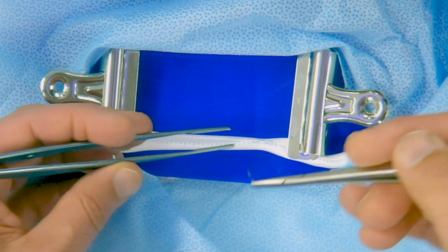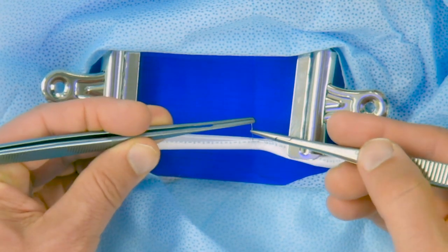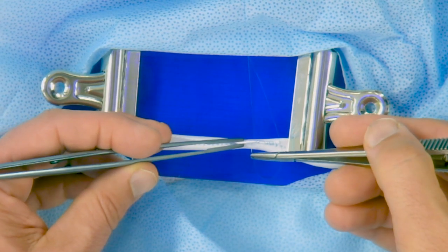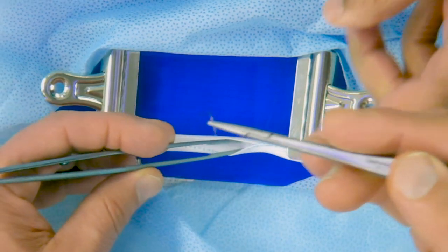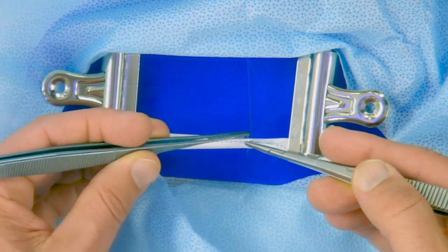Notice again that with each grasp, the needle is adjusted to prepare and orient yourself properly. Note as well that to get the suture to come down evenly across the anastomotic area, we're distracting the two edges of the graft as we pull the suture up and have the suture come down across the anastomosis.